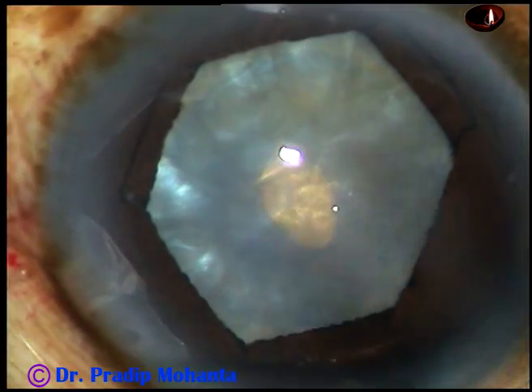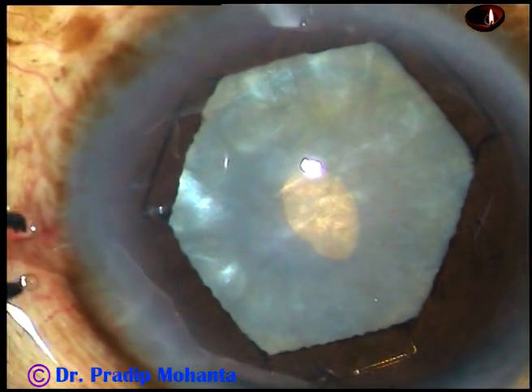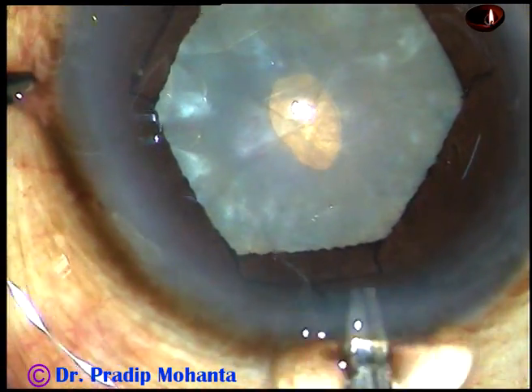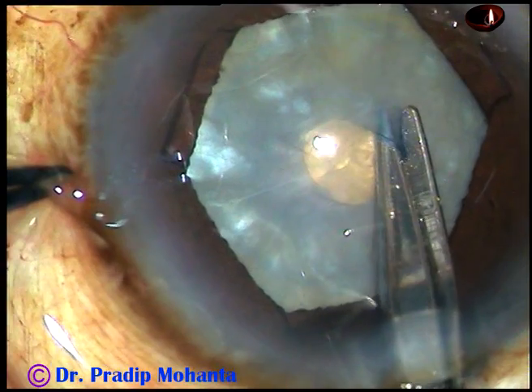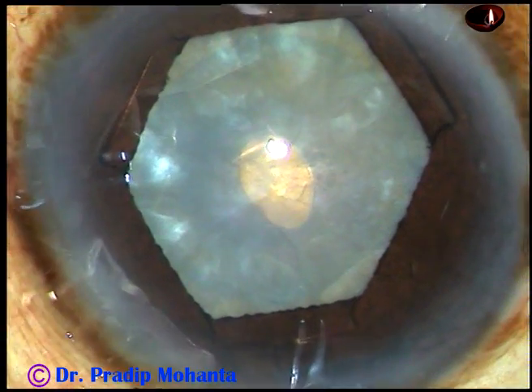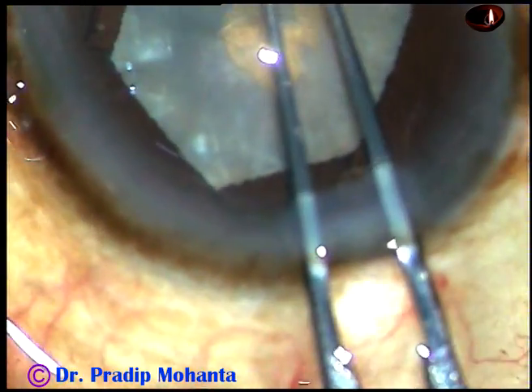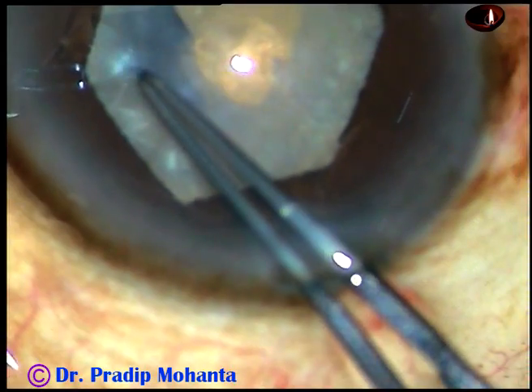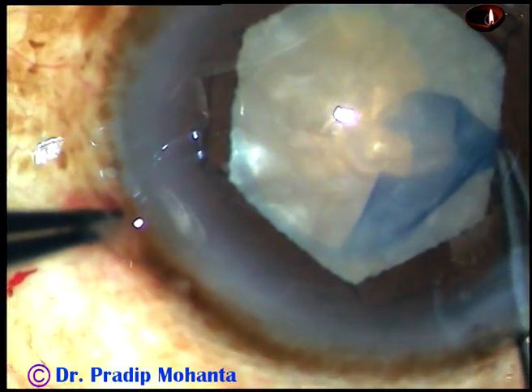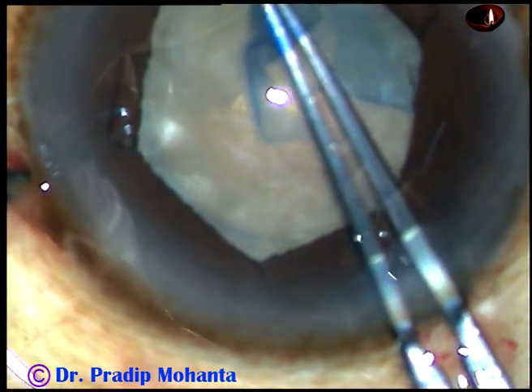And now you inject the viscoelastic substance again. Make a cut at around 8 o'clock — it should not be a radial cut, it should be a curved cut like this. Now I take utrata forceps, hold this, and then convert this mini-rhexis into an optimum-sized rhexis. This is going to be a rhexis of about 5.5 millimeters in size.